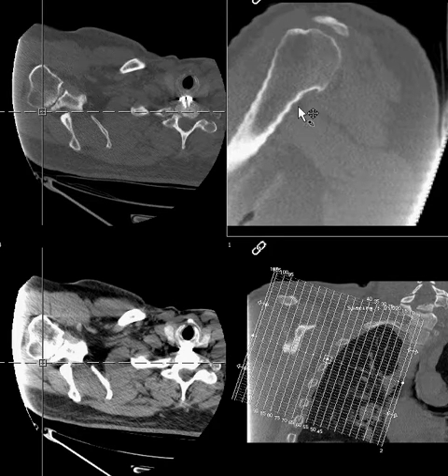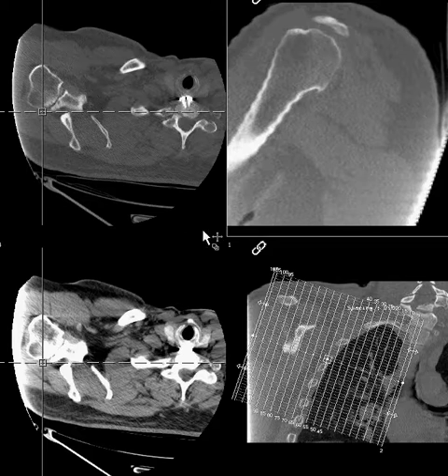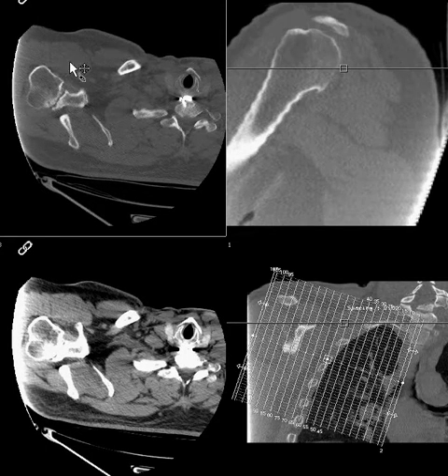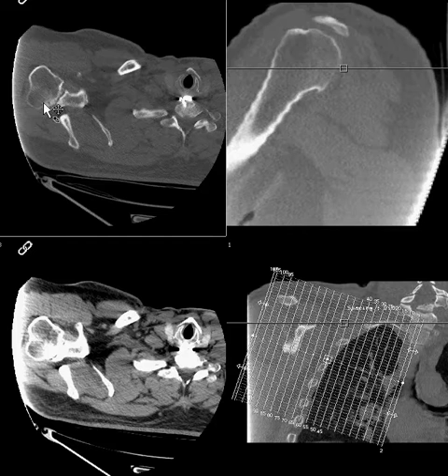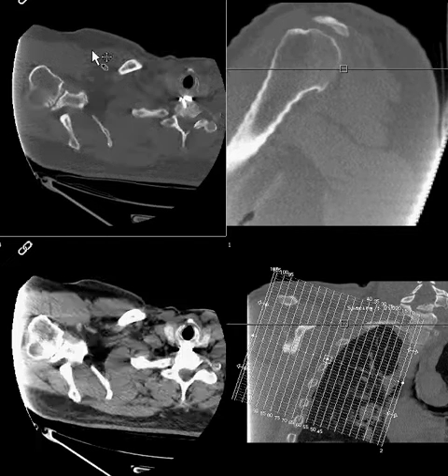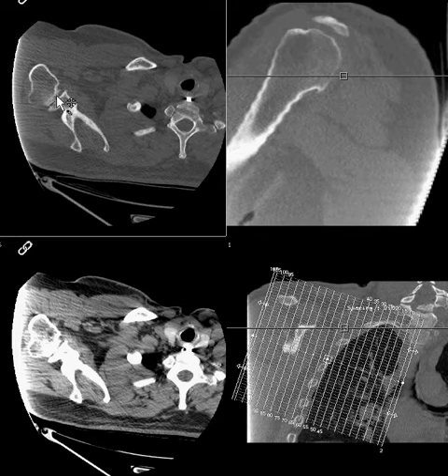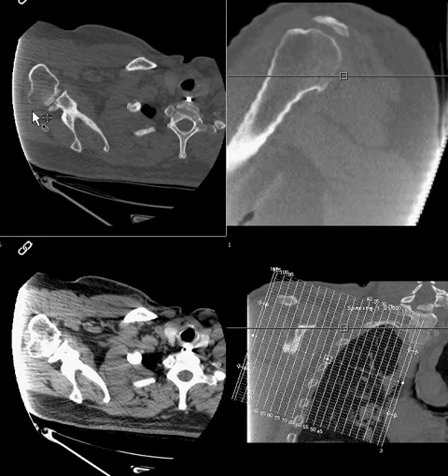One is, of course, reformat off of thin section data or raw data. And second is, when reformatting planes in the shoulder, it should be relative to the glenoid surface of the scapula, because this reflects the axis of the glenohumeral joint and should be either parallel to it or perpendicular to it.